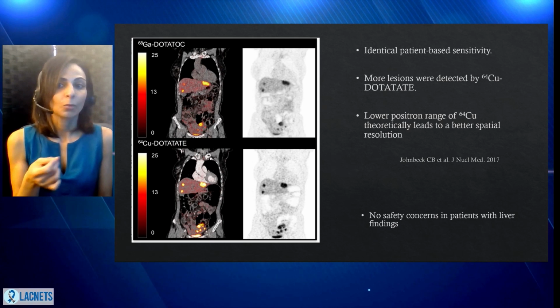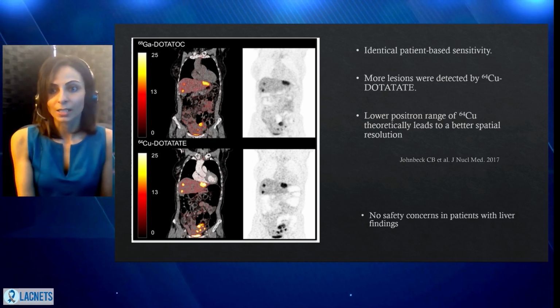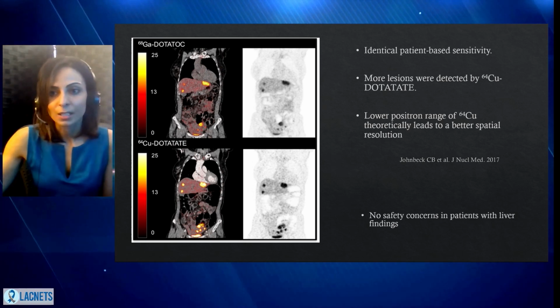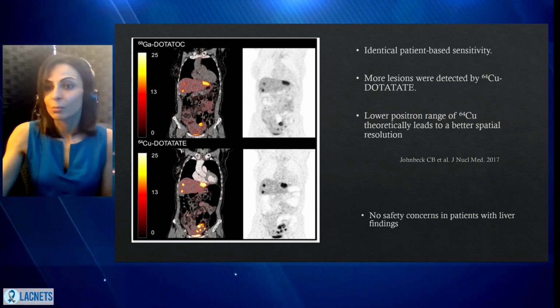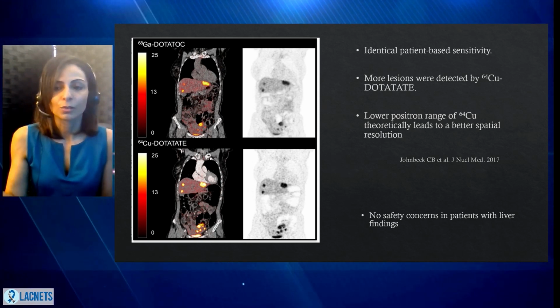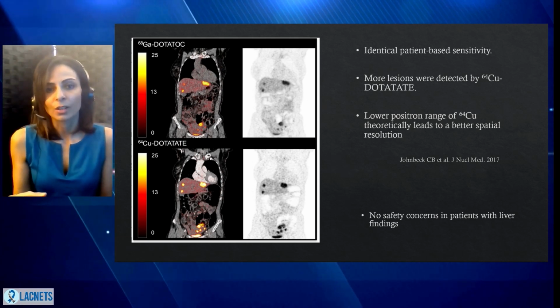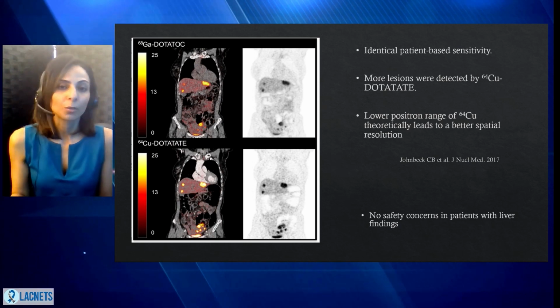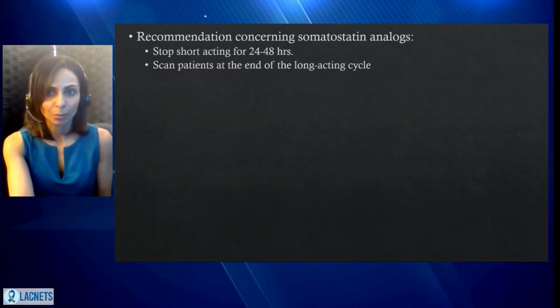Also, some patients ask, well, am I going to be radioactive after this? And although it is a radioactive agent, the amount of radioactivity is very small that there is no concern for other people to be exposed to it. So you can be close to your family members and there's really no risk to them. It's always a good idea to hydrate, whenever you get a radioactive agent, just to clear it quicker from the body, but there's really no risk to other family members or other people.